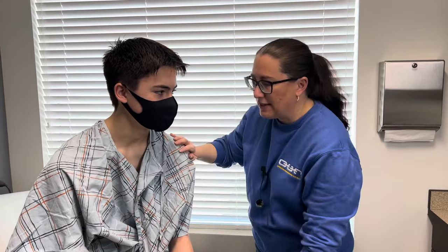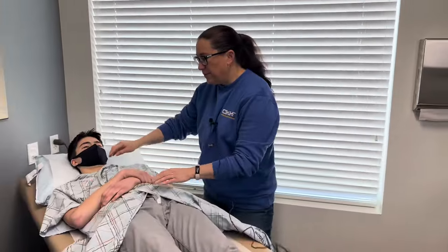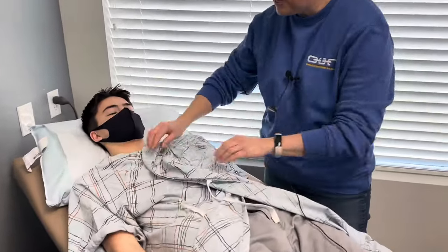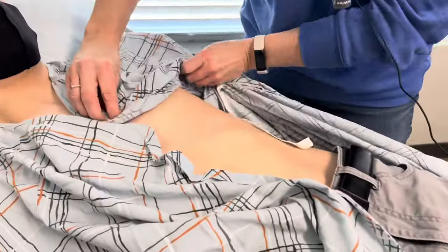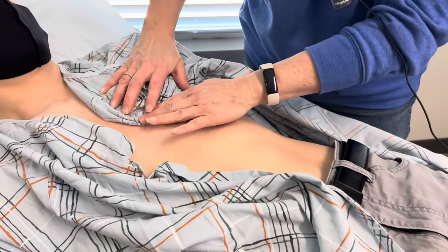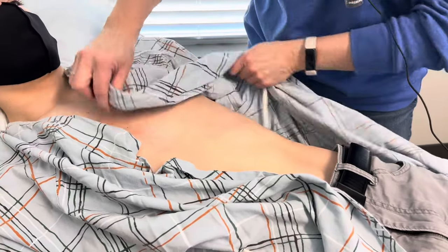This is my son, so of course he's a boy. But when it's a woman, you want to be really careful about modesty. Instead of having them just splayed open, often I'll have them go ahead and lay down. As we put the leads on, if it is a woman, I always make sure I tuck the breasts within the gown so they're not just laid all open.